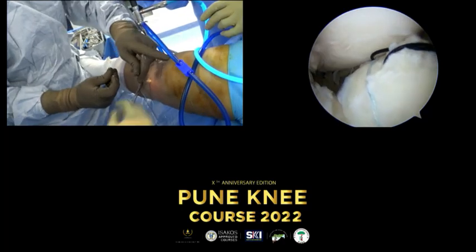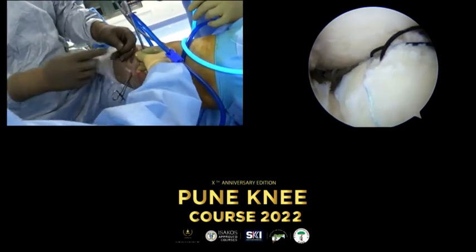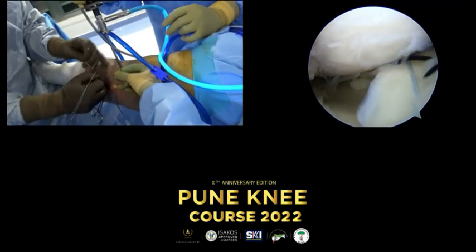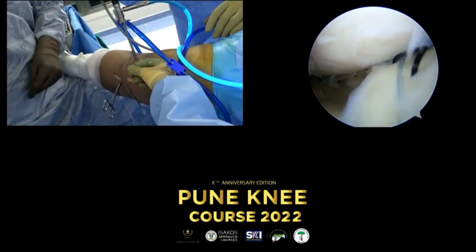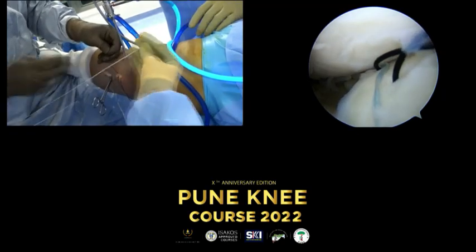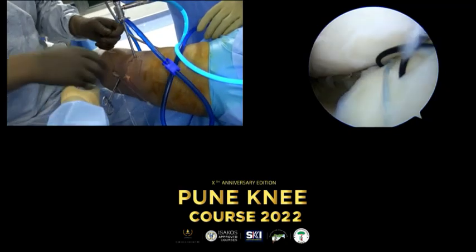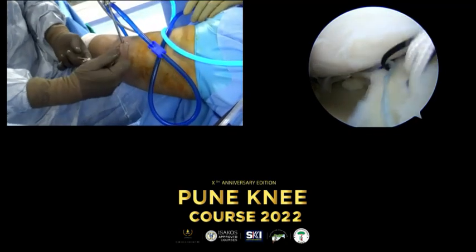Can you hold this? Do we have a number 2.0? Or is it, well, it's a 2. Okay, it's kind of big, but no problem. No, I normally use what I left from the meniscal repair. But I think we just throw it away. Here. We retrieve them.